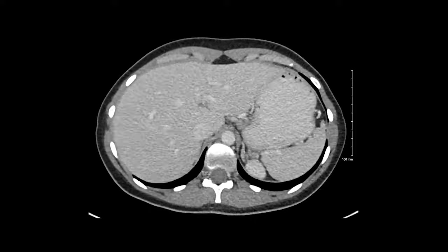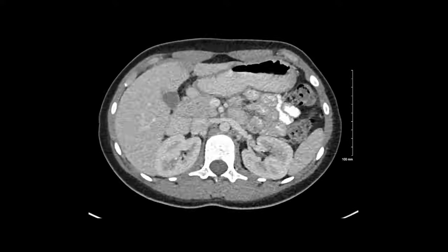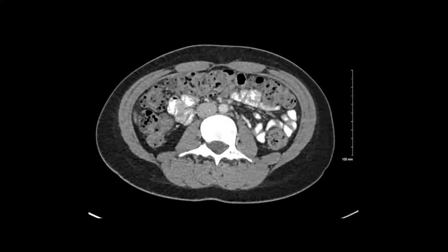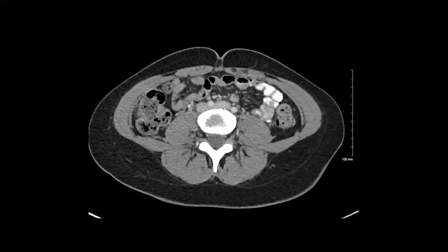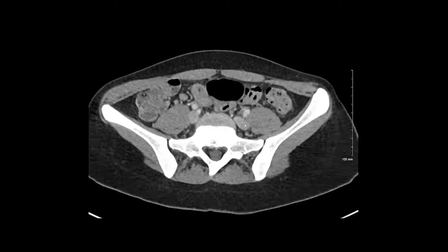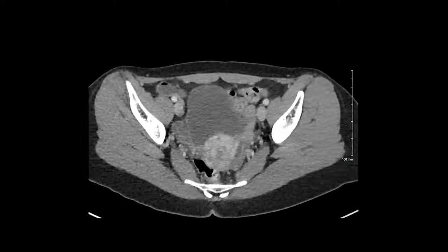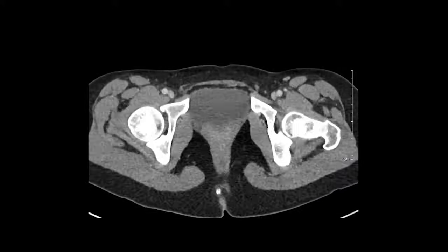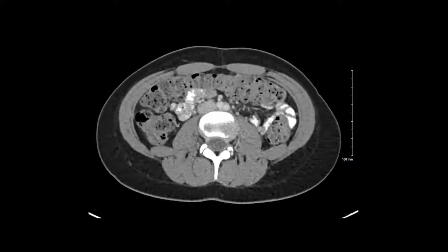I'm going to follow the IVC down, making sure it's normal in caliber and that we don't see any filling defects or other abnormalities. It's going to split into our iliac veins. And those iliac veins — again, I'm looking for filling defects, inflammation, dilation, or narrowing of the vessels. We don't see any of that.